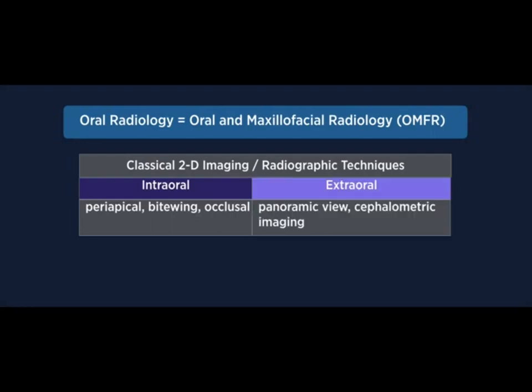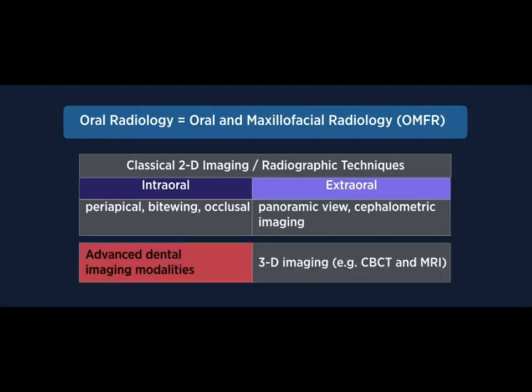Classical extraoral techniques are panoramic view, cephalometric imaging, but also three-dimensional imaging modalities such as cone beam CT, cone beam computed tomography, and magnetic resonance imaging, MRI. Three-dimensional imaging are also often referred to as advanced dental imaging modalities because basically two-dimensional imaging include intra and extraoral techniques which are normally used in general practices quite frequently.